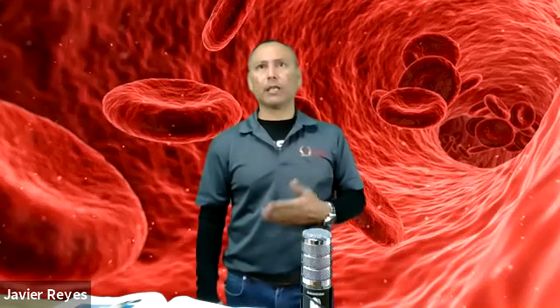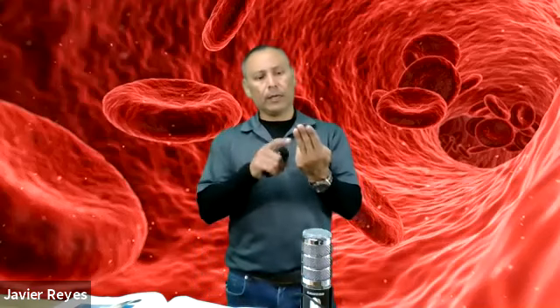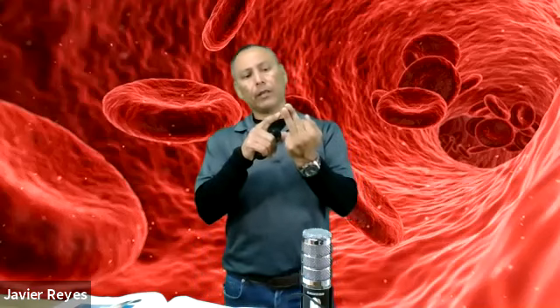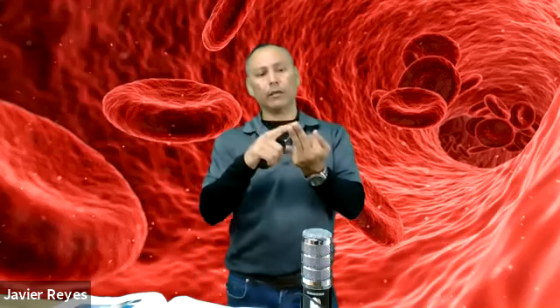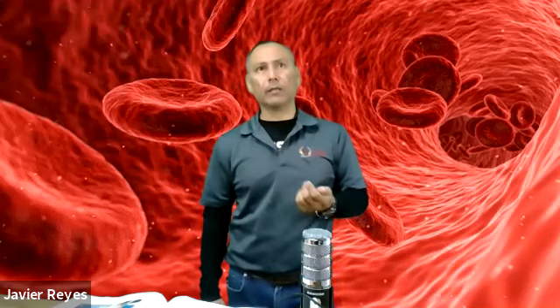In step 6, we're going to select the puncture site. Usually we're going to puncture in the lateral or medial sides of the distal end of the finger. Usually you want to arterialize your specimen. Remember, use those warming devices over the area so you have increased blood flow to the area. It makes it easier for you to collect your specimen, and it'll be faster. The skin should be warm, pink, and a normal color. If you see that the hand is purple or blue, you definitely want to arterialize it. You want to warm it up before you even start.